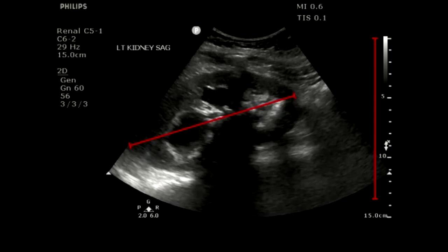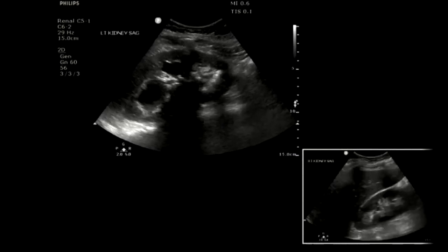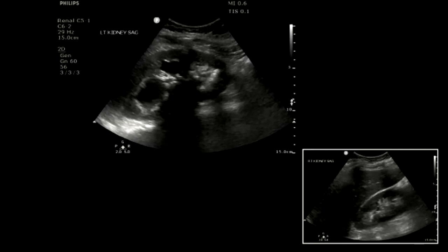First, we look at the size — it measures about 13.5 centimeters long. For reference, about 11 centimeters is normal, so it's slightly enlarged. Maybe something inflammatory given the fever. Second, look at the collecting system: you can see dilation — we're tipping into the moderate hydronephrosis range. You can see it in the superior pole, kind of in the middle portion of the kidney, and the inferior pole looking a bit odd. Comparing to the other side, we can definitely see something abnormal in the collecting system — it's enlarged, there's some unilateral obstruction. So we have a slightly larger kidney, some obstruction, and hydronephrosis.